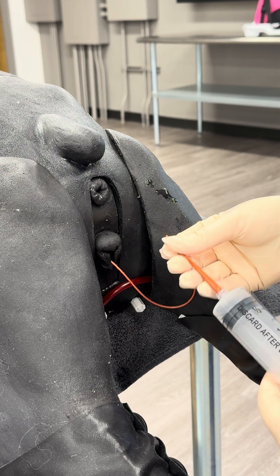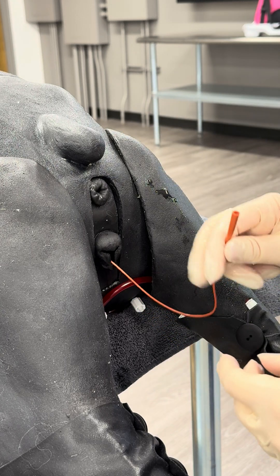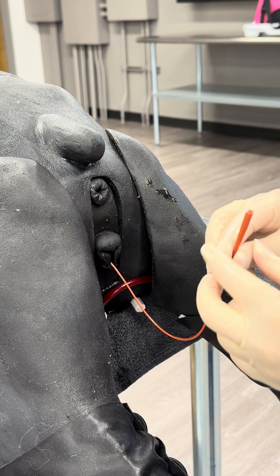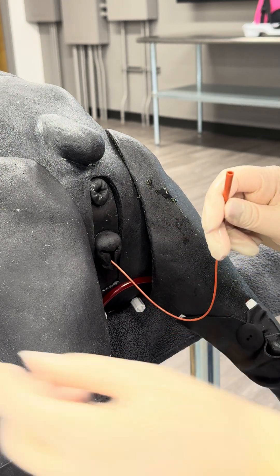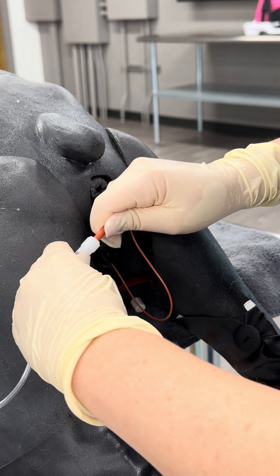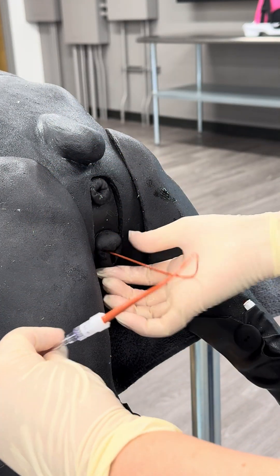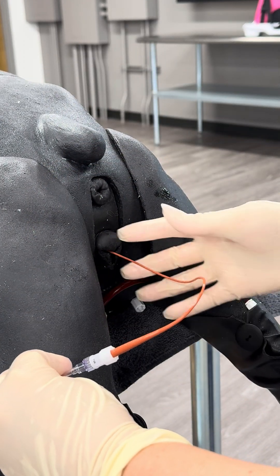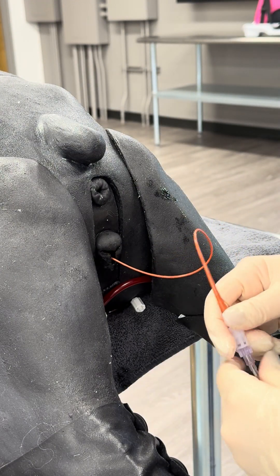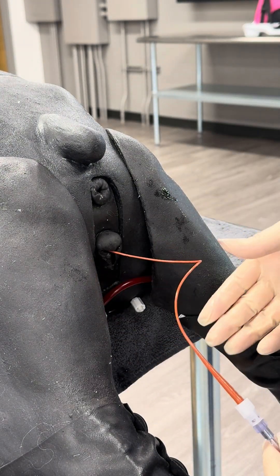The urine in this dog is clear, so I've got a little bit of urine in my syringe. Once I've confirmed I'm in the correct spot, I'm going to secure this catheter, probably using a finger trap suture of some sort, and then hook up to my closed collection set. You can do additional securing by grabbing some of the vulva tissue and doing a finger trap around this tube. If you have a Foley catheter, you won't need to do that — you can simply inflate the balloon and that will keep it from leaving the urinary bladder.